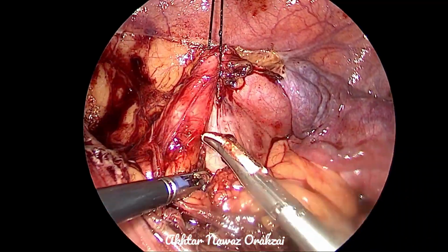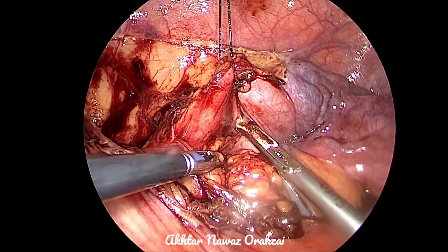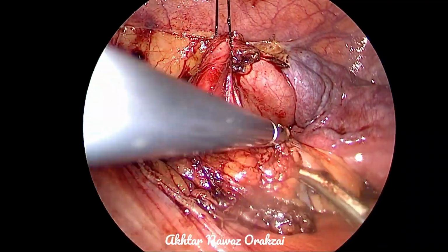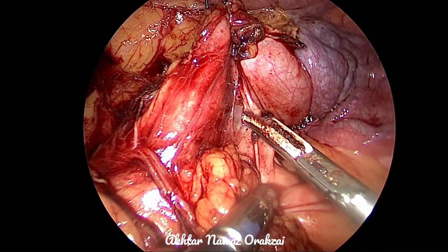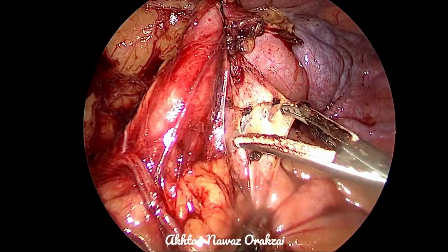Now we can clearly see the course of the ureter. We'll try to mobilize it, leaving some tissue near the ureter.